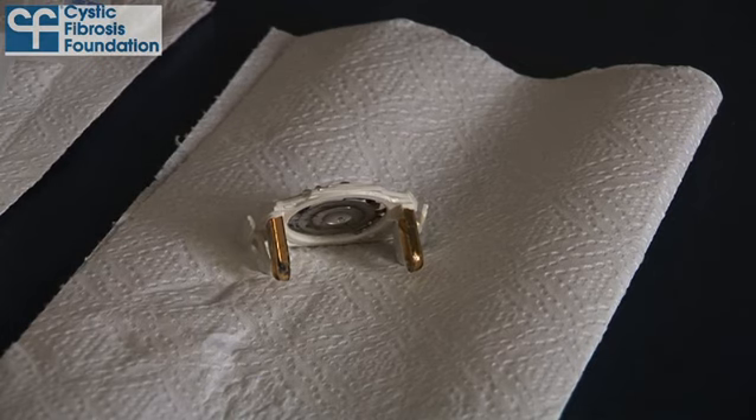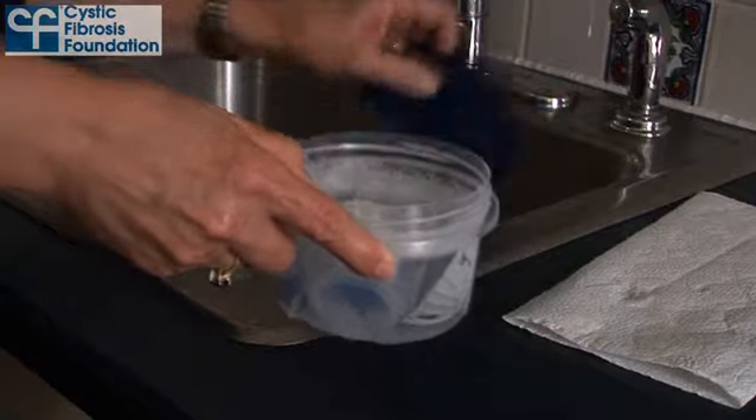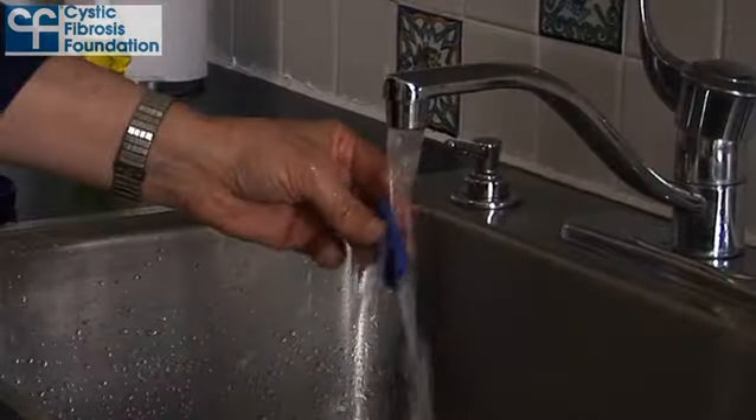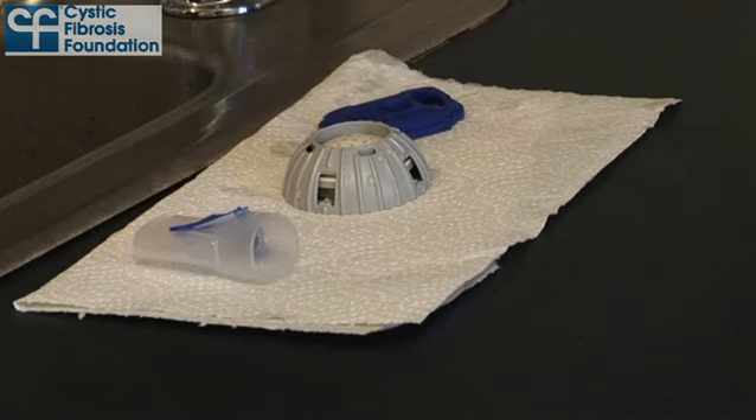Be sure not to place the aerosol head face down or it may pick up fibers from the towel. Next, put all of the other parts of your nebulizer into the bowl and wash by gently shaking the bowl. When you have finished cleaning each part, rinse it under warm running tap water and place it on a clean lint-free towel or paper towel.